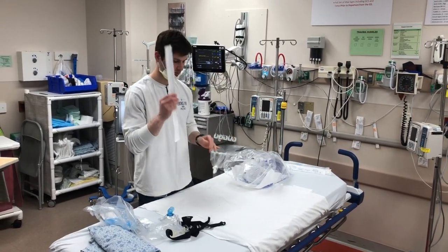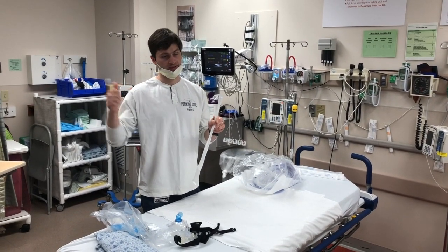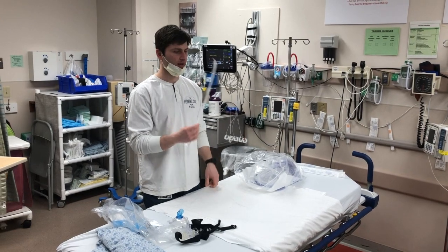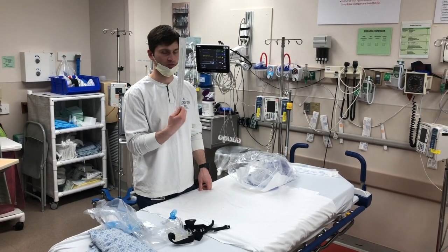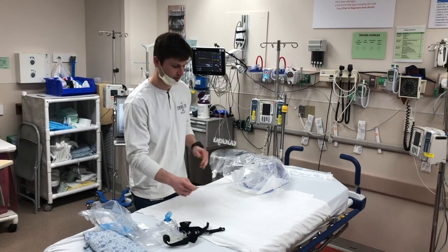You have a regular stylet. We're trying to intubate everybody with the GlideScope, at least in the ILI unit, or any other type of video laryngoscopy over in the main if you have a main patient with ILI. But presuming that some docs will want to use a regular stylet, we're including a regular stylet in every pre-ox kit. If you want to use the GlideScope stylet, that will be on the GlideScope also.